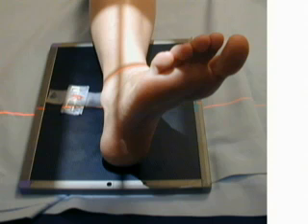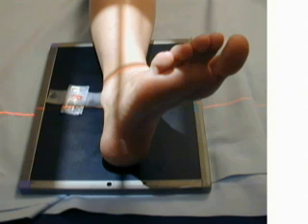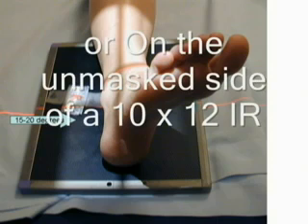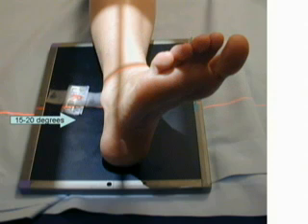The medial lateral oblique or mortise view projection of the ankle is performed with the patient seated on the table. A leg shield should be placed on the patient's lap for radiation protection. Have the patient extend the affected leg, placing the plantar surface of the foot in a vertical position on an 8 by 10 inch image receptor. Immediately rotate the entire leg and foot 15 to 20 degrees, placing the intermalleoli line equal distance from the image receptor.